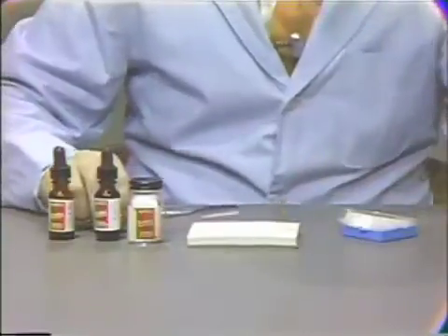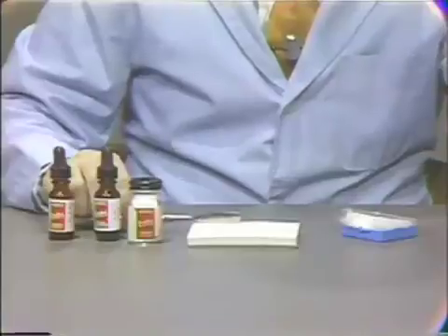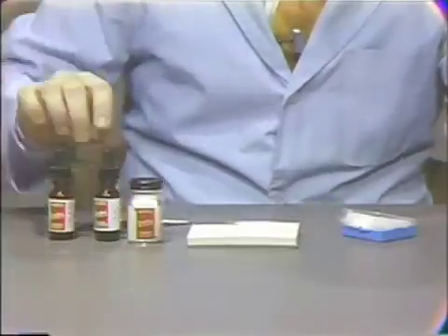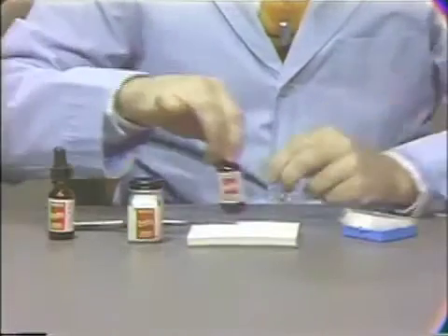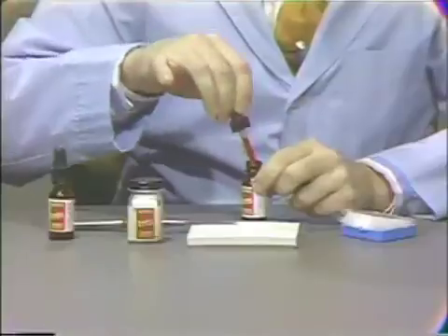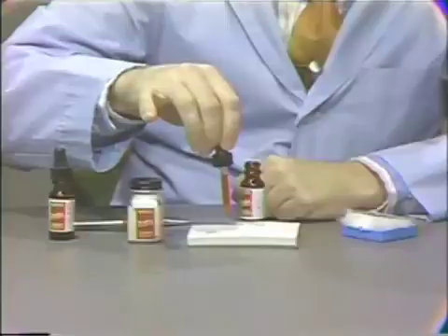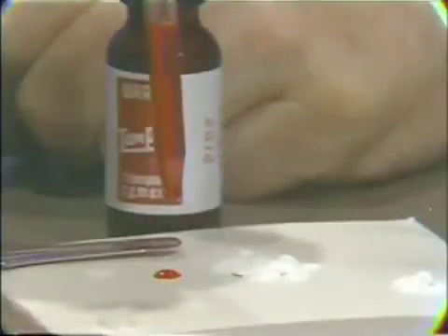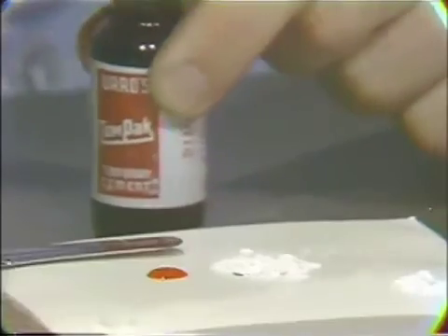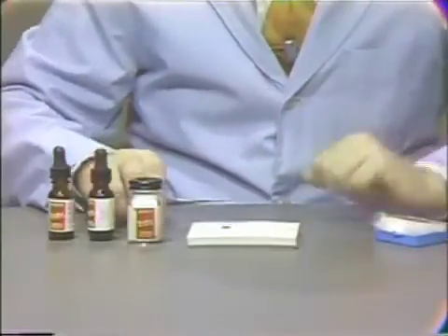In mixing, the large Tarno mixing spatula should be used — the heavy one — in order to incorporate the powder as quickly as possible. In dispensing the liquid, the dropper should be held vertical and two drops placed out on the pad. Dispensing of the liquid should be the last procedure prior to initiation of the mix.